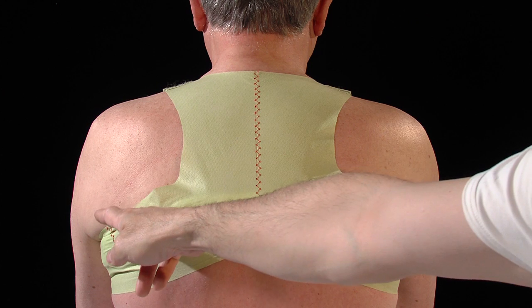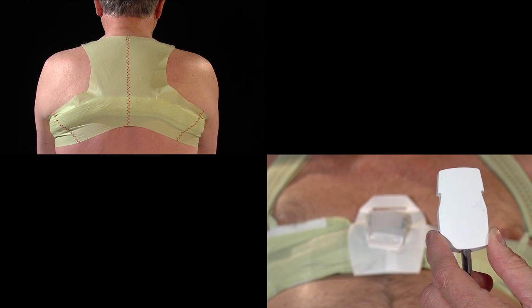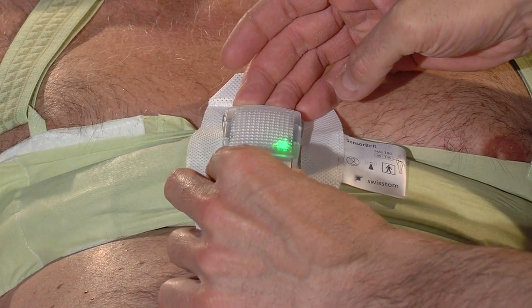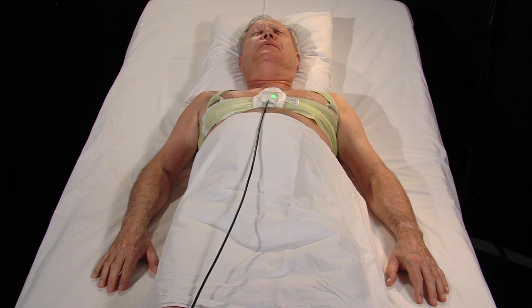The sensor belt is now ready for use. Insert the rectangular plug on one side of the sensor belt connector into the docking station until it clicks into place with an audible sound. After a few seconds a green light indicates a successful connection.